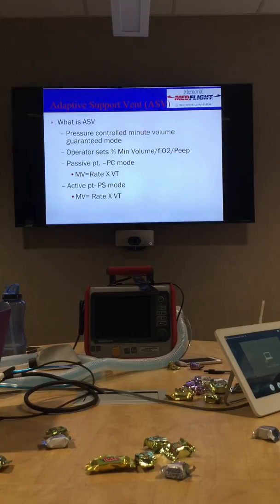Yeah, they're on a vent, but let's say now they have a little bit of secretions. Well, if they're not coming out of the tube in the aircraft, I don't really know that they have increased secretions other than what my vent's telling me. So, this vent is sitting kind of back here behind my hip. Unless I'm looking at it constantly or I hear it alarming, which we do, but it may be a minute or so into it.